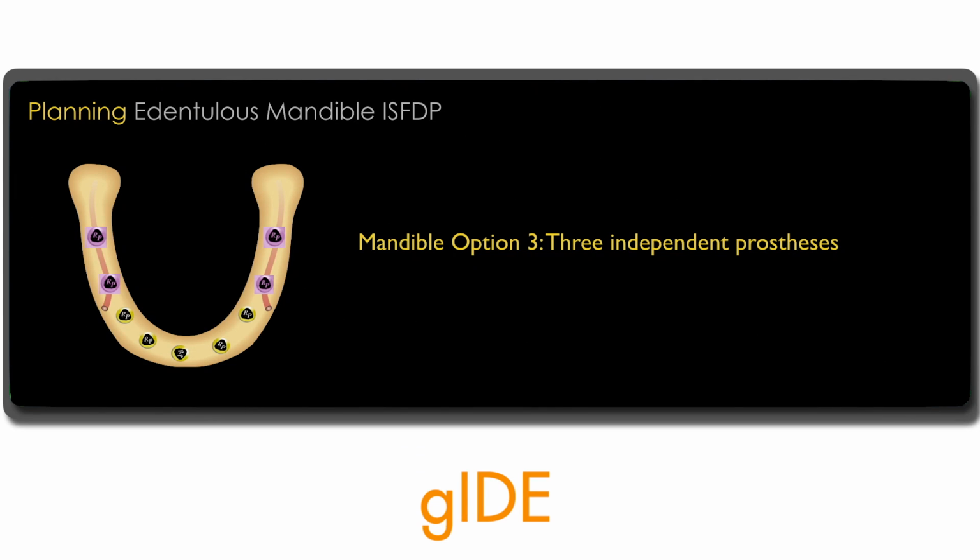Now, option 3, if you're going to place implants in the posterior mandible, it may be best to segment the prosthesis. So in other words, you might have 2 implants in one side of the posterior mandible, you'd make a splinted bridge. On the other side, you'd make a splinted bridge. And then in the anterior portion, you'd have another separate segmented bridge. So here, in this situation, you'd actually have 3 separate bridges.